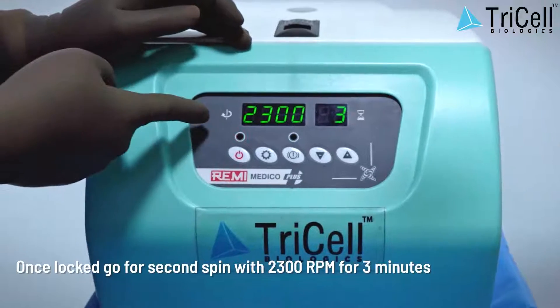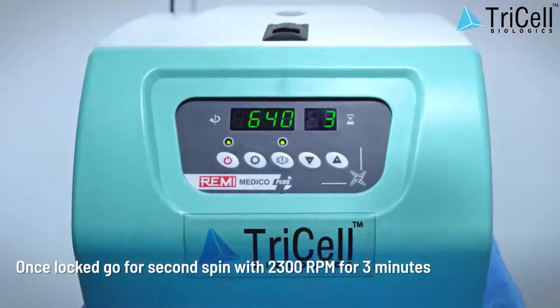Step 8: Once locked, go for the second spin at 2300 RPM for 3 minutes.